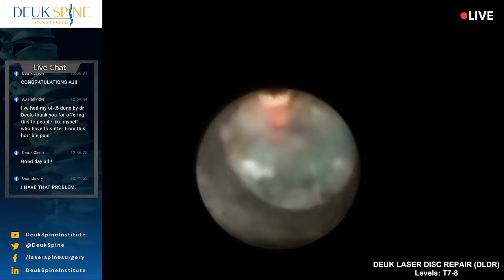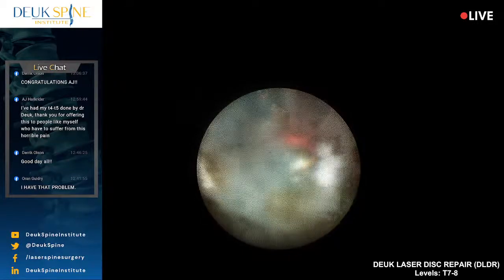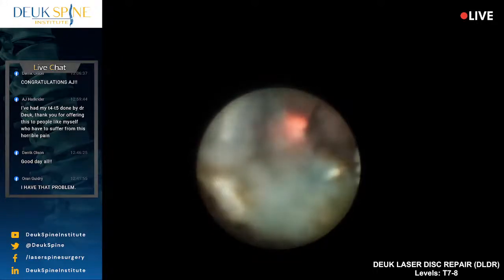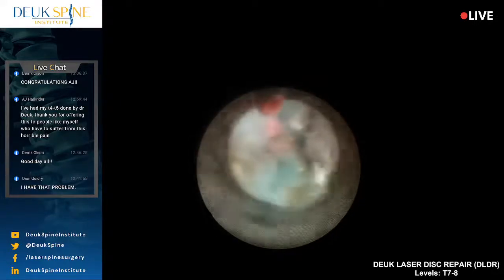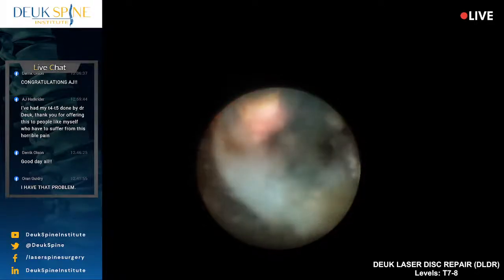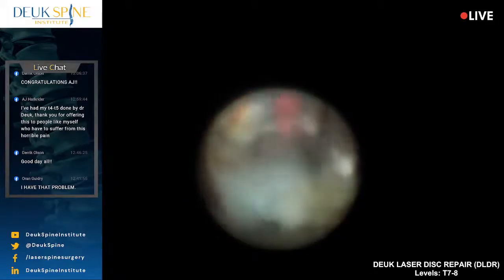Does that make sense? Yes, sir. And I don't know if they can fix fiber optic scopes where you've been sending them. They can? You want to give it a try? Yeah, definitely. Have they fixed a cervical scope before? Yes, sir. Is this one that they fixed? I need to check my notes. Yeah, check your notes, because if they fixed this, then they didn't fix it. So we need to either have them redo it, or we need to send it to Wolf.